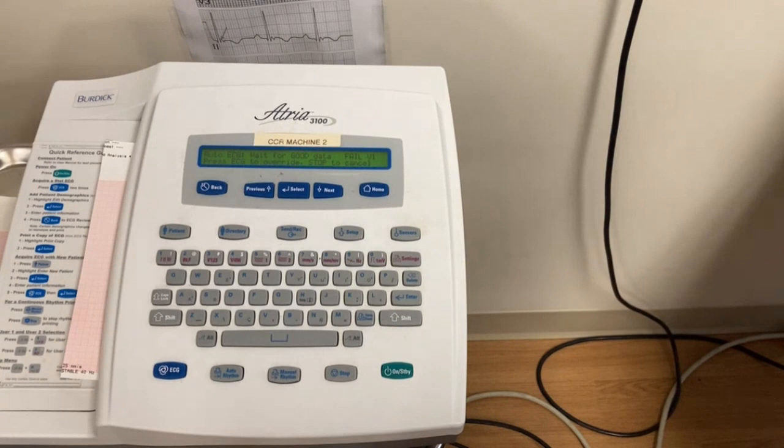Once the patient is sitting on their hands, count slowly to ten — because the EKG is recording ten seconds of the heart's electrical activity. This gives time for all the artifact — meaning movement or noise you don't want to record — to clear out. You want to see good, clean, crisp data showing what's actually happening in the heart, not the patient wiggling around.